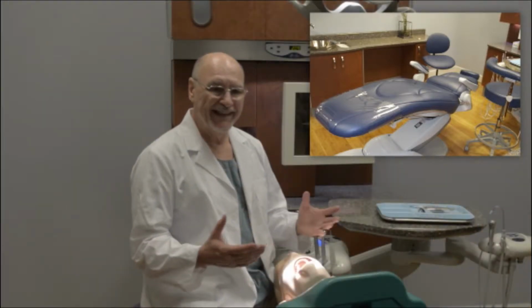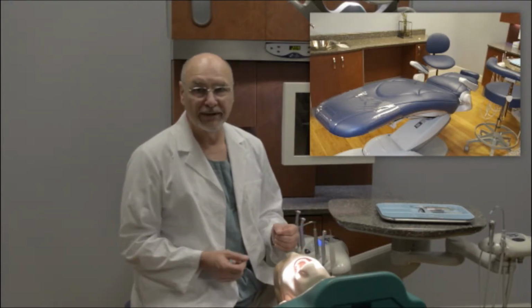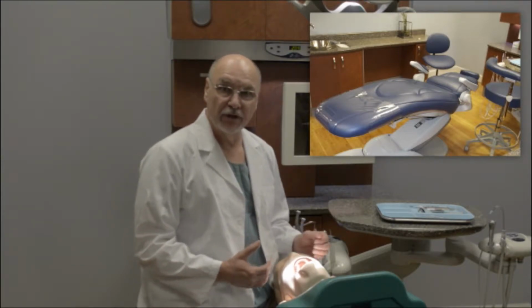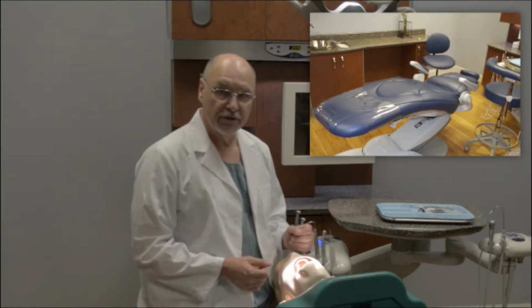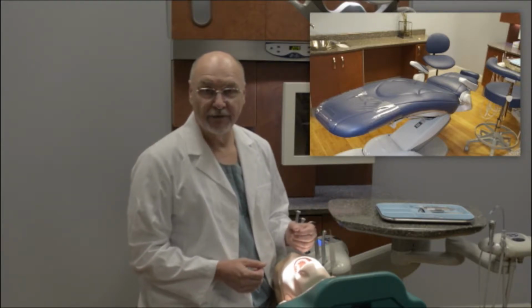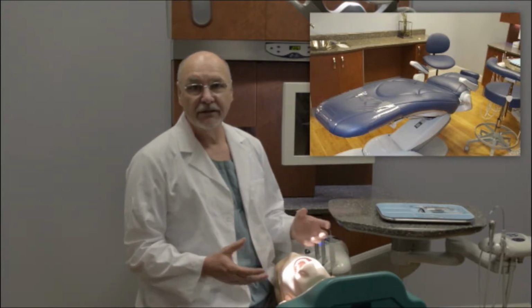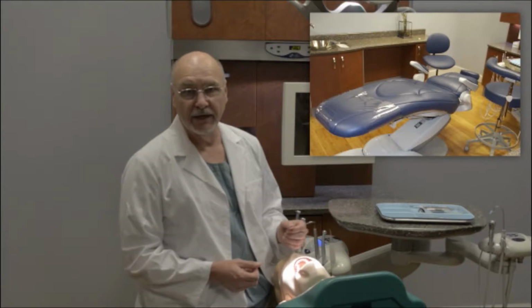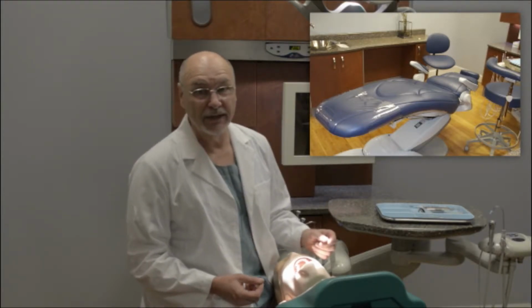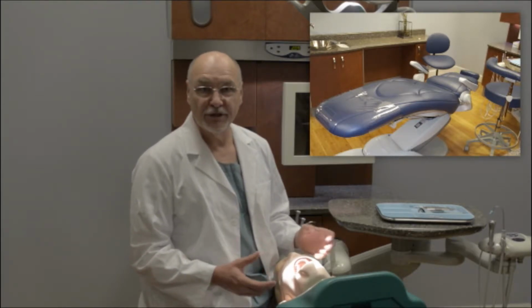In order to be able to have patients accept this position, many times it's very important to give them a benefit statement as to why they're going into that particular position for that procedure. And the most fail-safe method of being able to convince them that indeed this is necessary is to let them know that today the doctor is going to be treating a particular area, and in order for the doctor to see what he's doing or she's doing, the patient needs to go into a particular position.